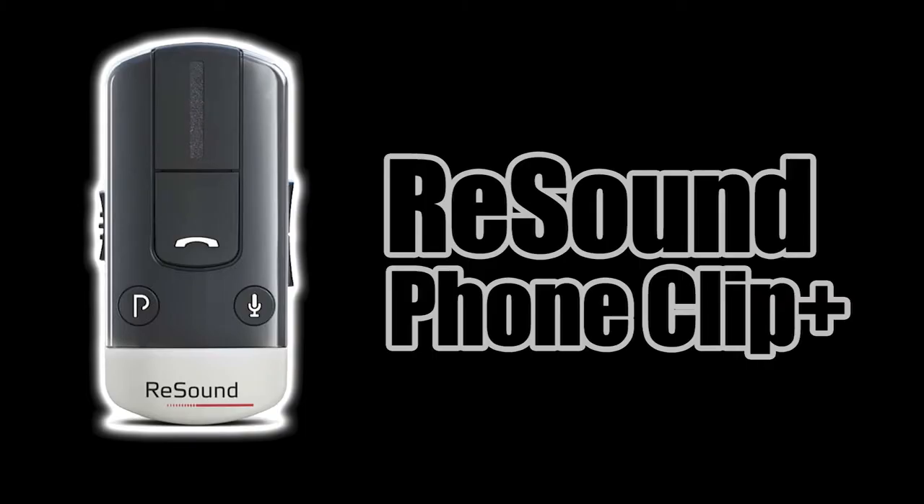Next, we're going to talk about the ReSound Phone Clip Plus. This device allows you to connect any Bluetooth phone to your hearing aids. My hearing aids, the Enzo 3Ds, connect straight to my phone via the ReSound app, so this tech is a little bit older — it's dated. If you're going to put thousands of dollars into hearing aids, get the Bluetooth and skip the accessories. Although the mics are game changers. If you are a student from elementary school to college, I highly recommend a mic. But as far as this phone clip, it's dated — only get it if you have to.